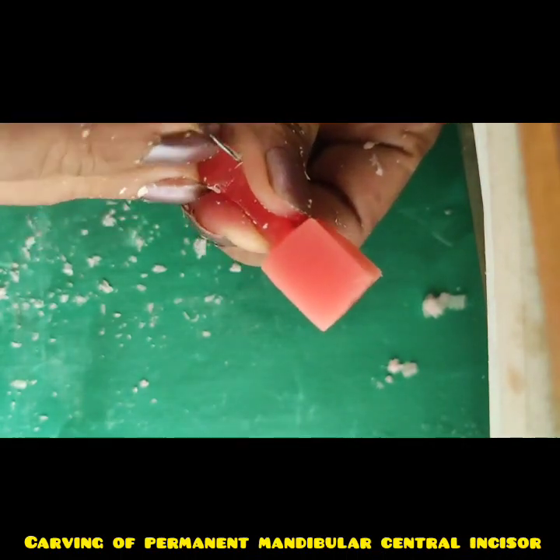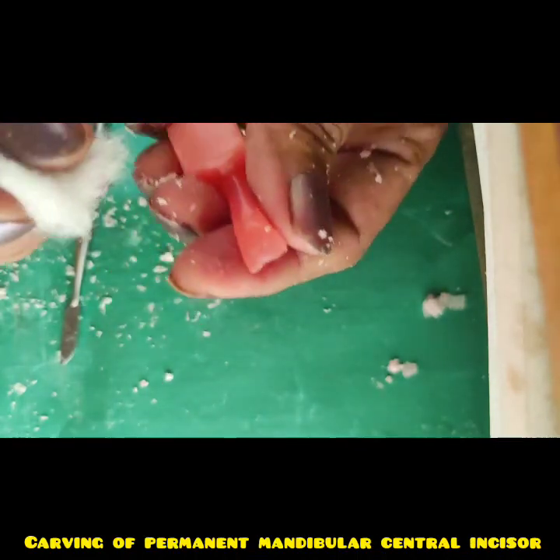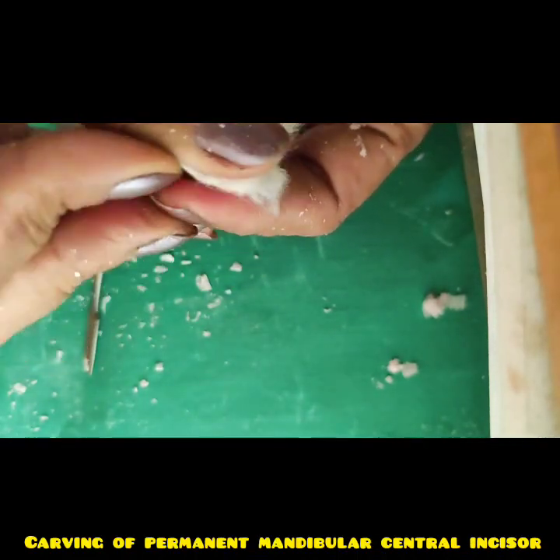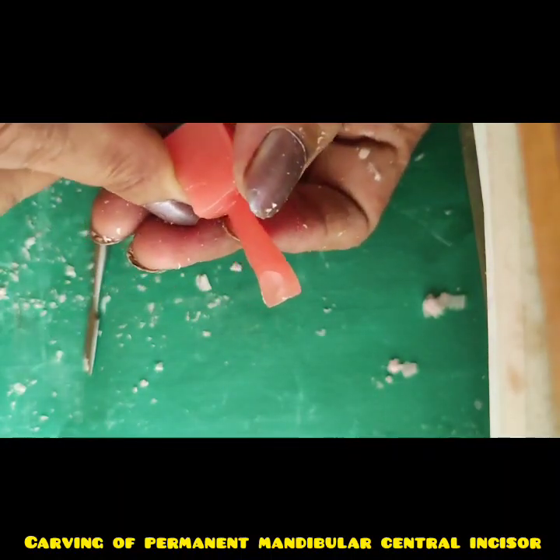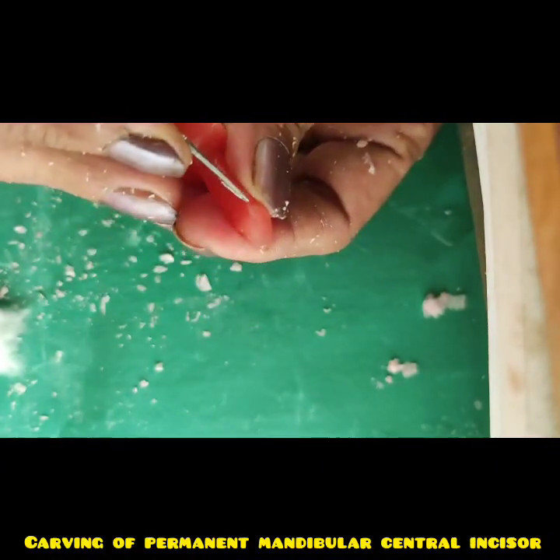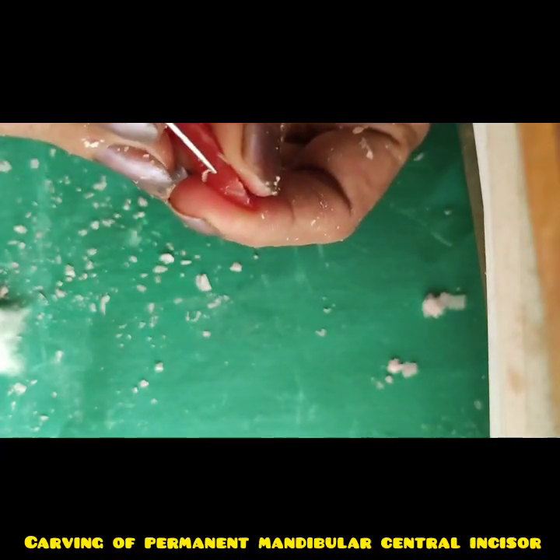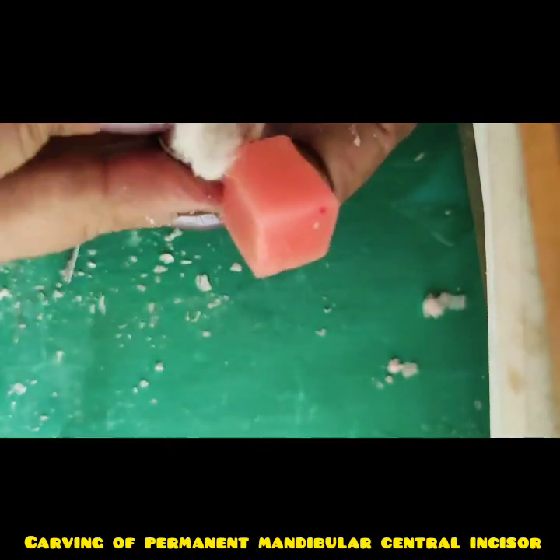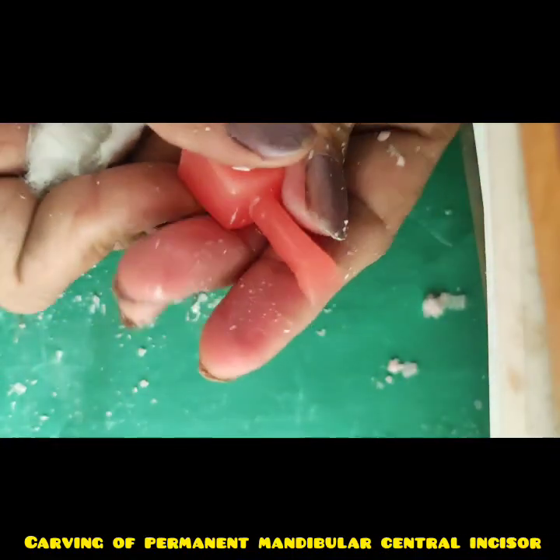I will define the cervical line so that the crown margins can be very well appreciated, like this. You can see this, and define the cervical line on the proximal also. The convexity is towards the crown on the proximal, like this.